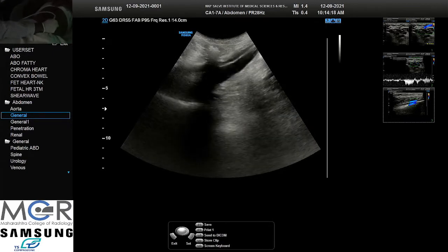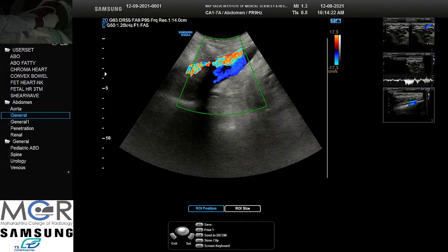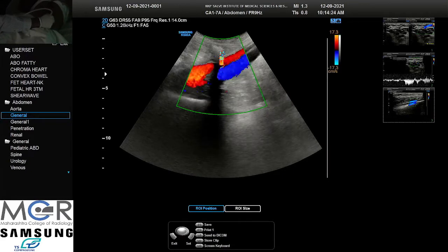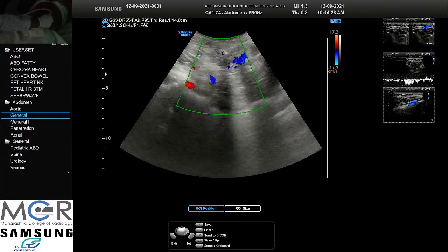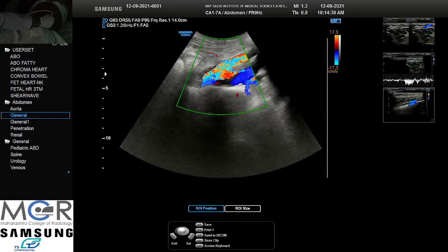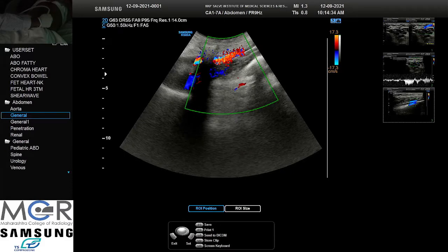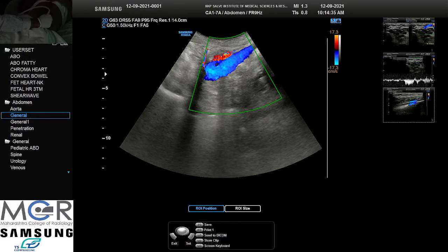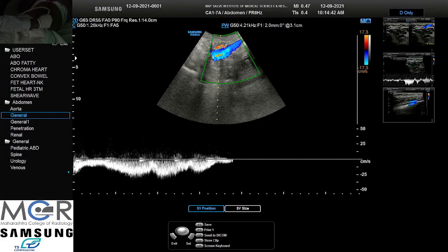Sometimes there are masses in the pelvis region, or there are old thrombus in the iliac level that may give rise to the varicosity. So we see the external iliac vein and artery and just confirm the flow. So normal flow, this part is normal.